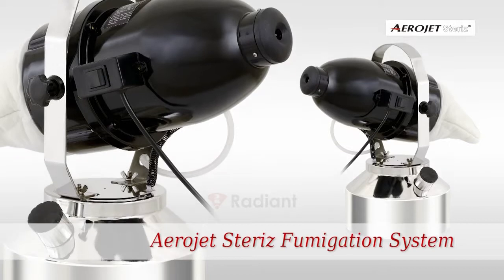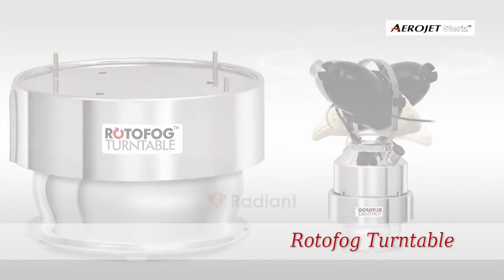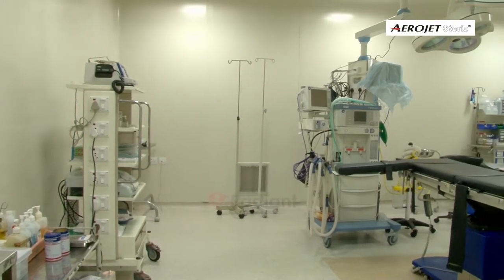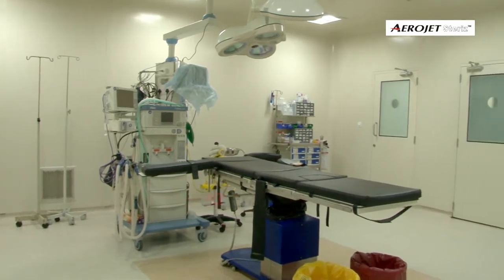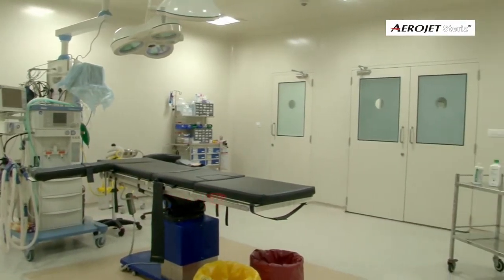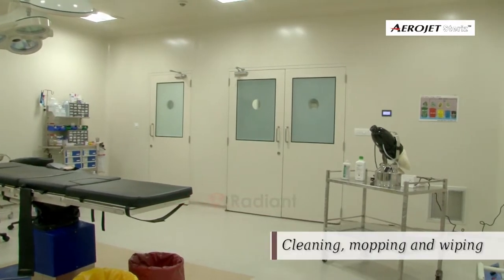Please follow the installation process of Aerojet for airborne disinfection of the treatment area. The treatment area should be absolutely dust and dirt free, and subjected to a thorough bio-cleaning process which includes all accessible and inaccessible surfaces subjected to cleaning, mopping.